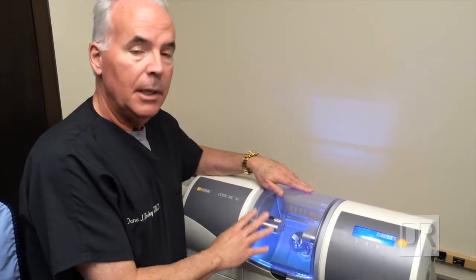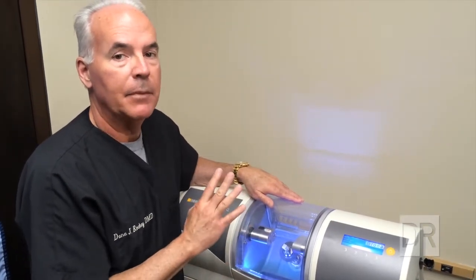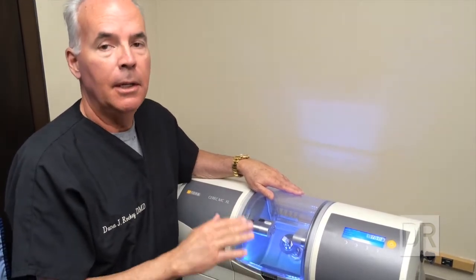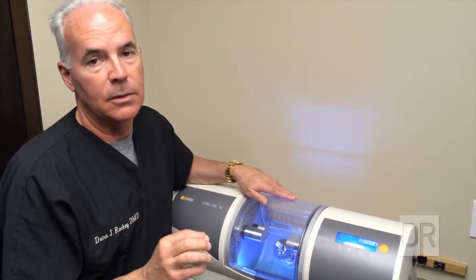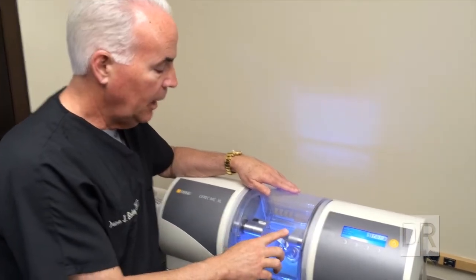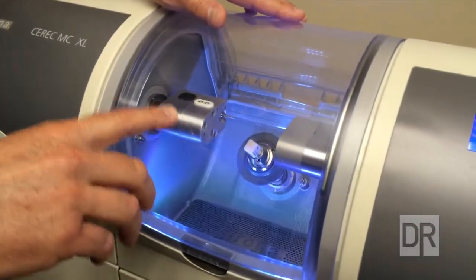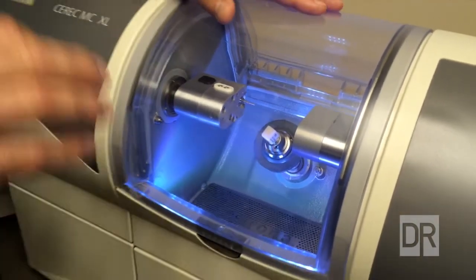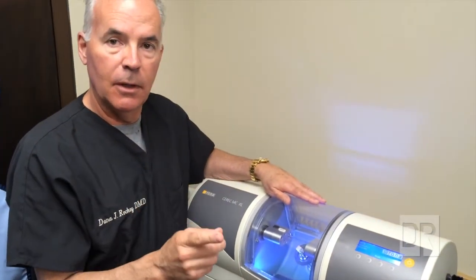Here we have the milling unit for the CEREC equipment shown previously. The camera got the photos of the tooth we drilled on, the software manipulated that, and once it came up with a solution — the exact size and shape of the porcelain piece — it wirelessly sends that to the mill here. As you can see, the mill has two drilling heads on each side with a block of solid porcelain in the middle. When you give it the okay, it starts, checks itself to make sure everything's working right, and then exactly grinds that piece to the exact specification the computer called out.